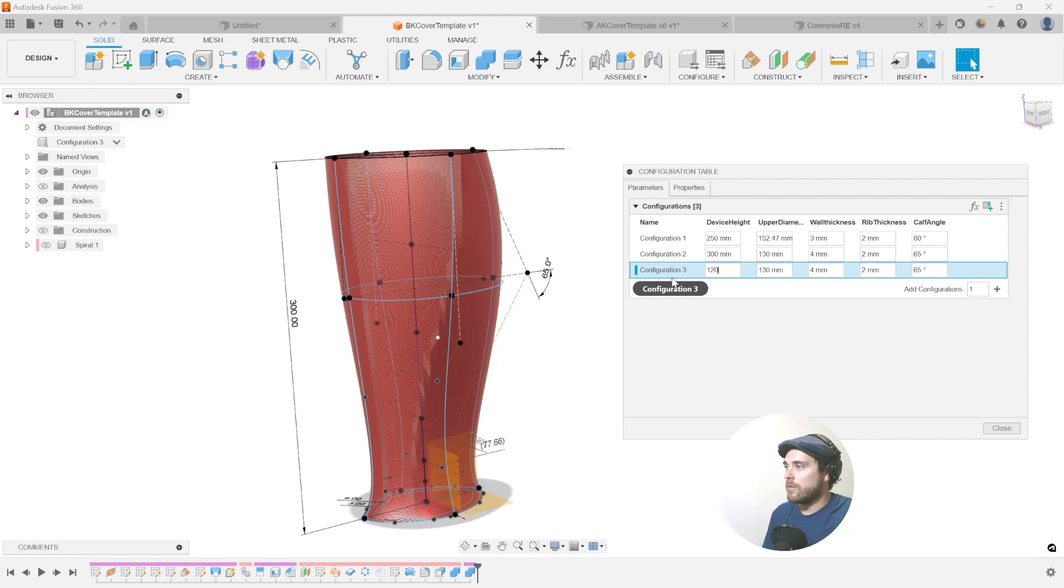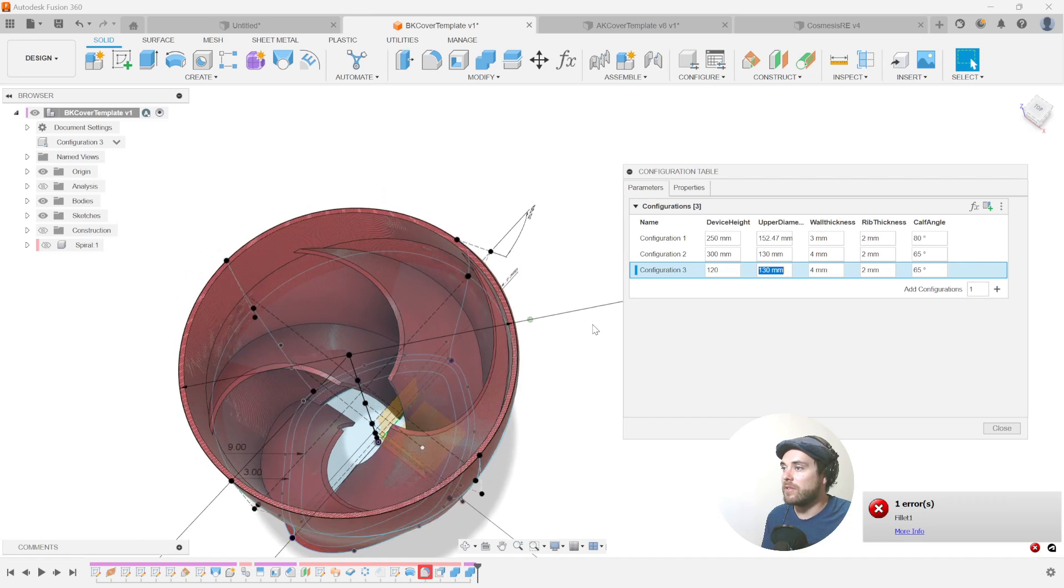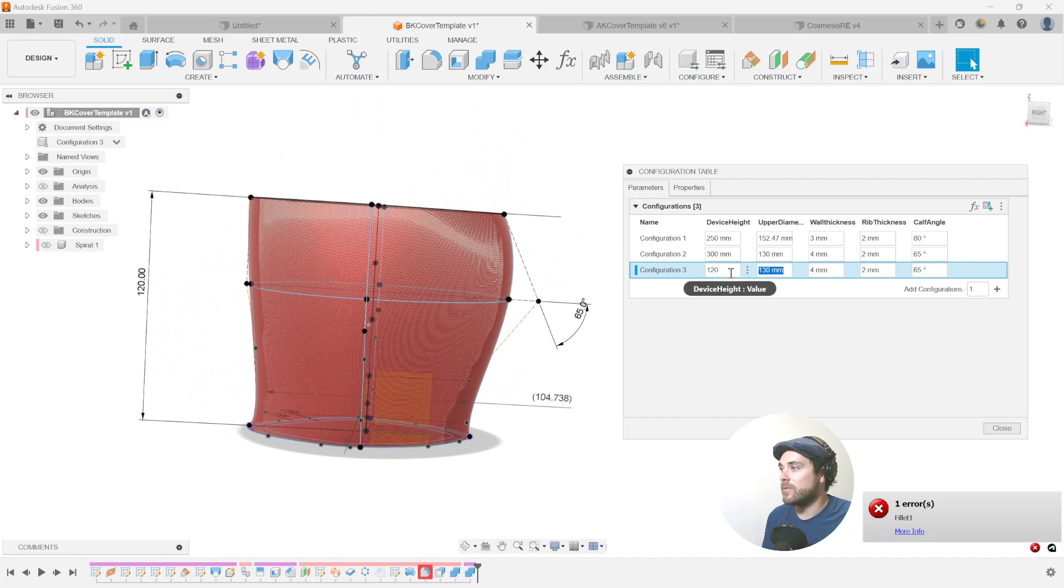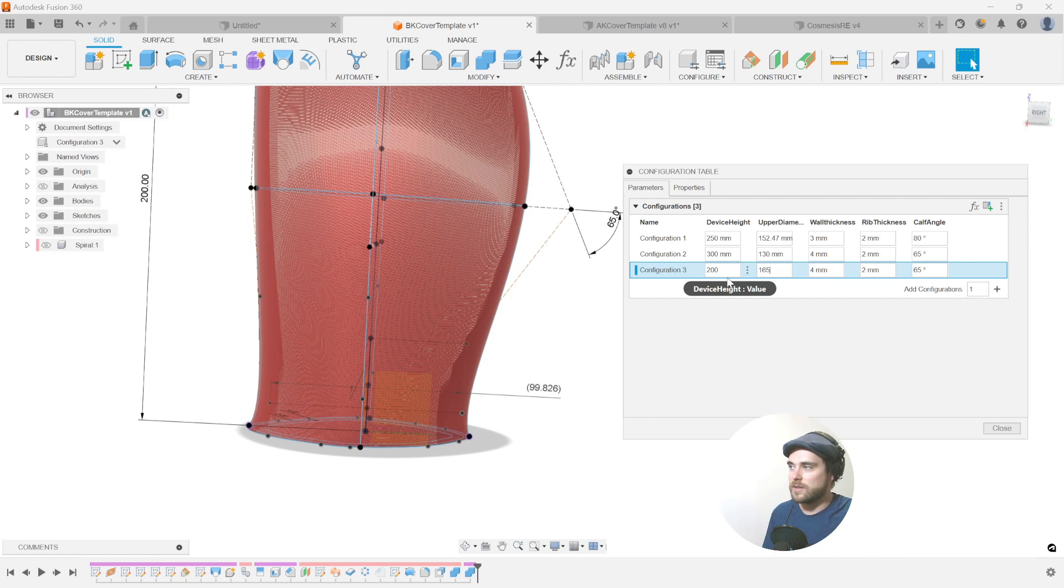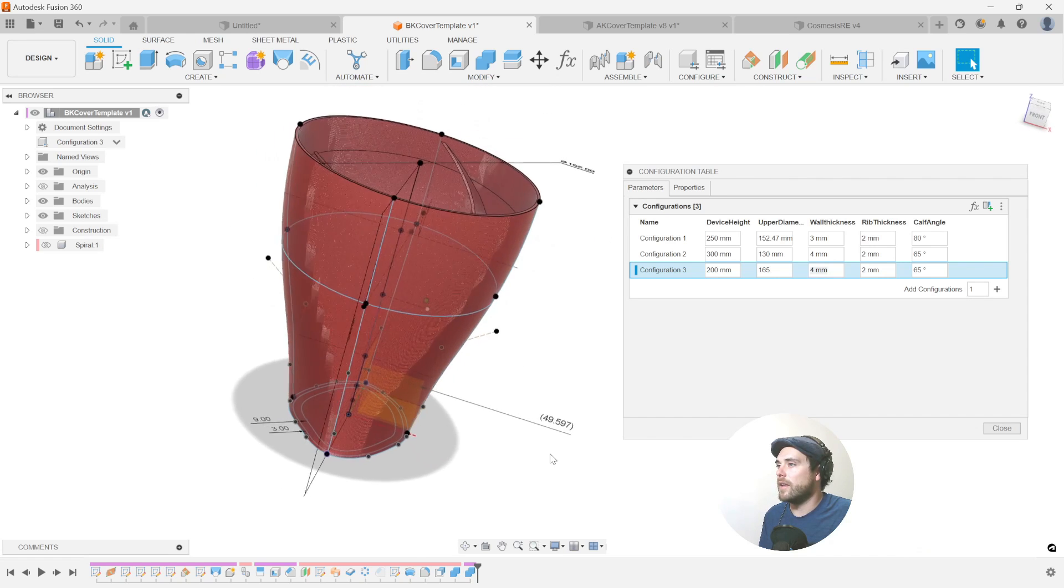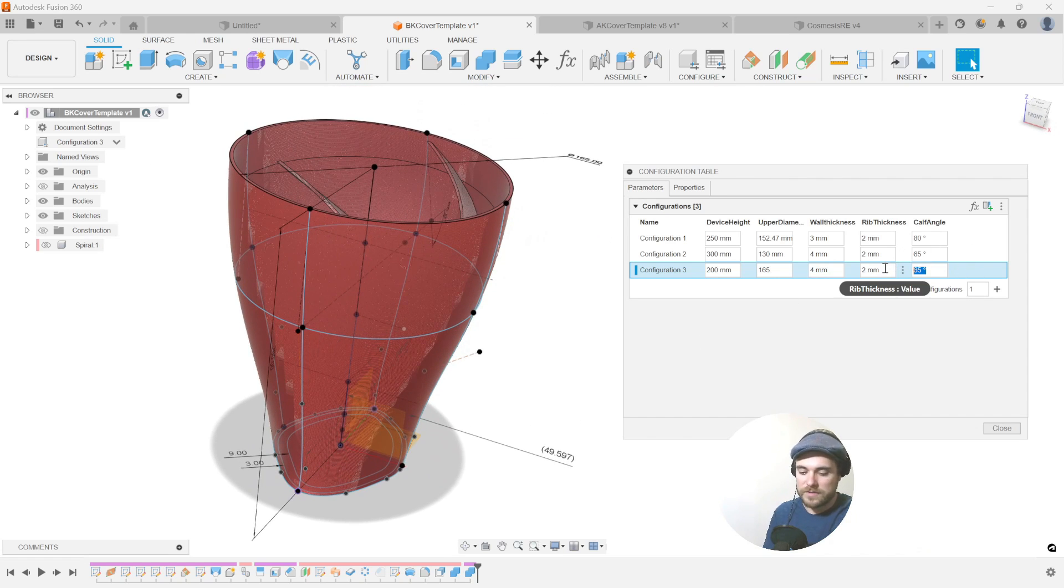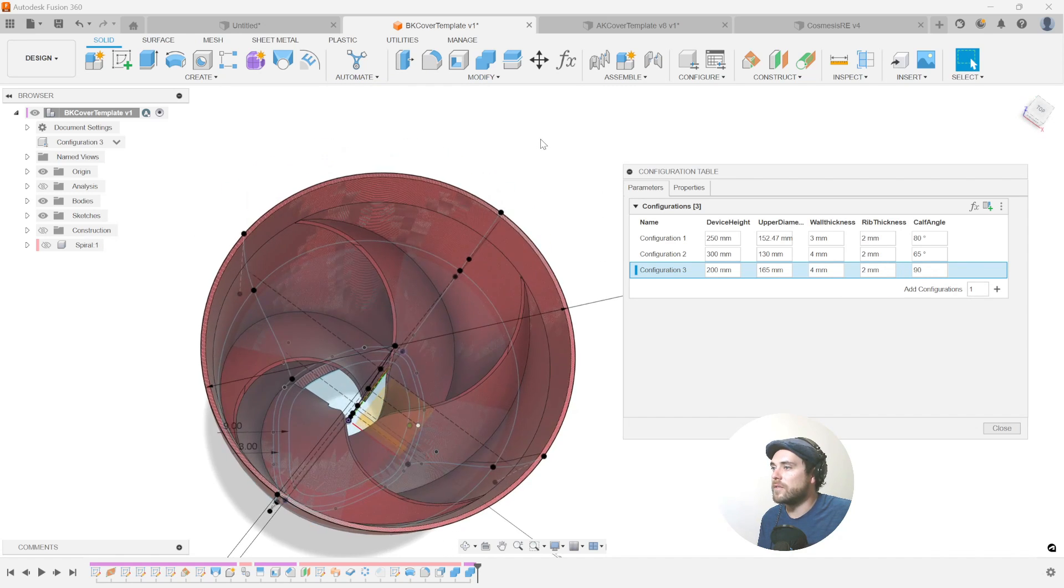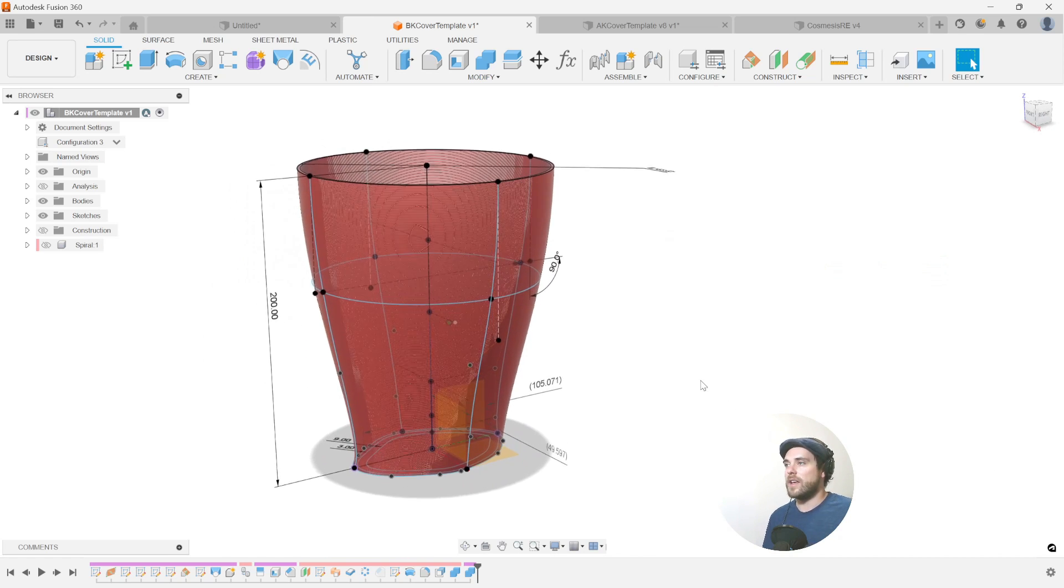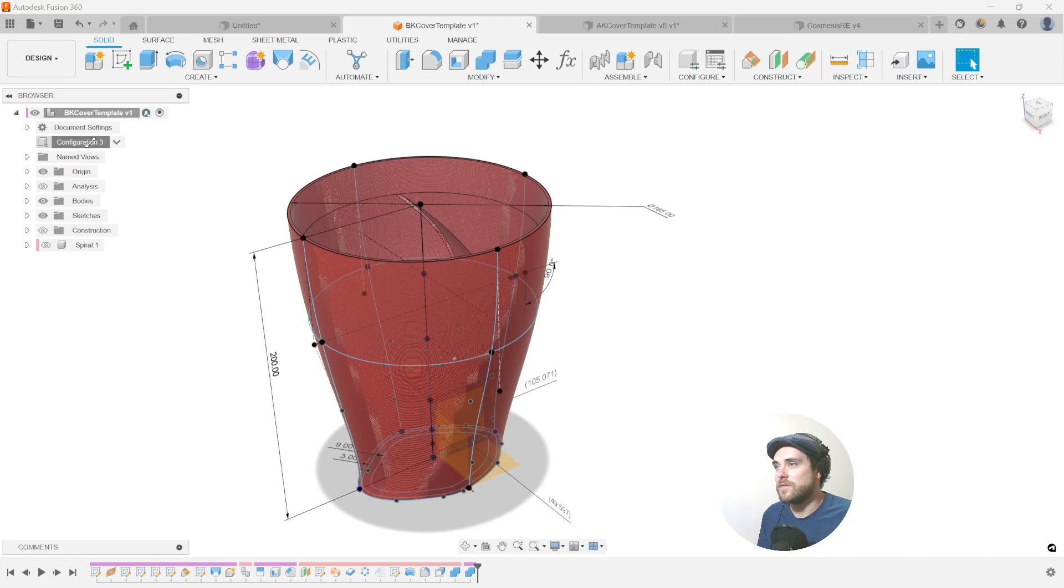And it's that easy now to go in and make different variables and variations of this design. So we can make a shorter one now. A very short one. But notice how everything updates. And we're able to change everything about this nice and quickly. So maybe make this a little bit taller. We'll make the upper diameter something much larger. Say this is a different morphology. And then we can change the calf angle to something a little less affording. So maybe 40 or 90 degrees. There we go.